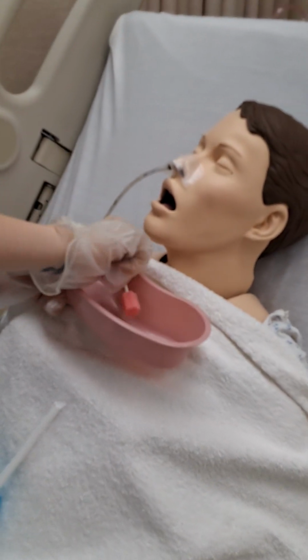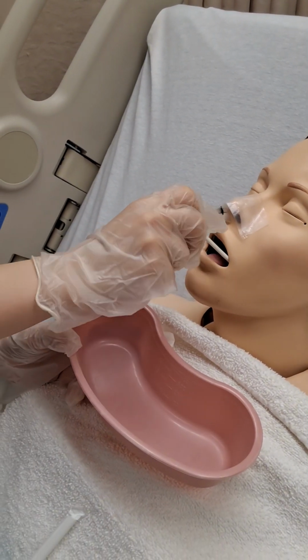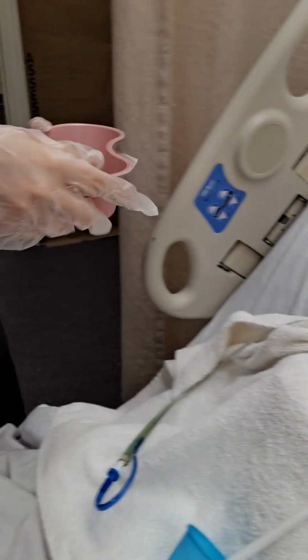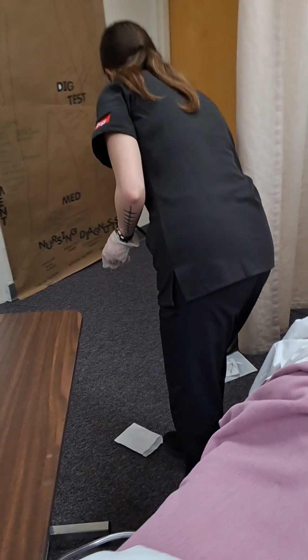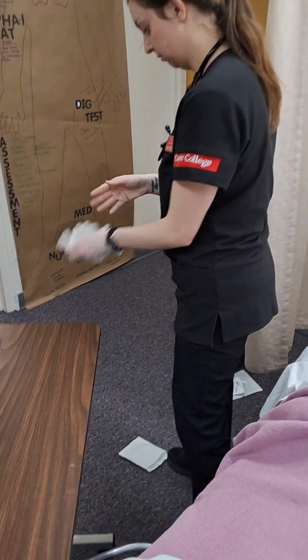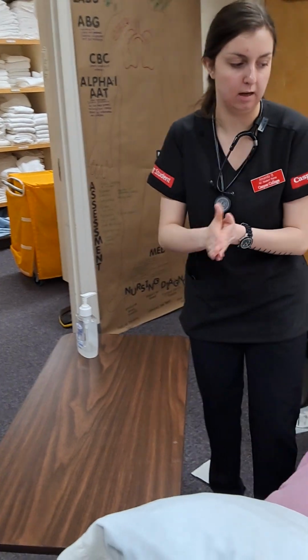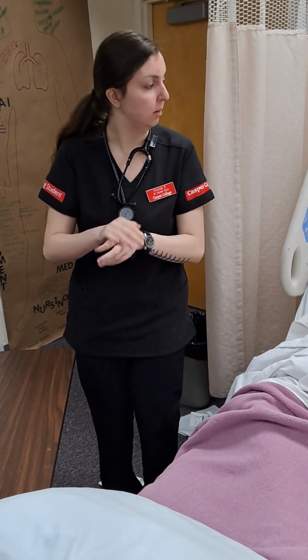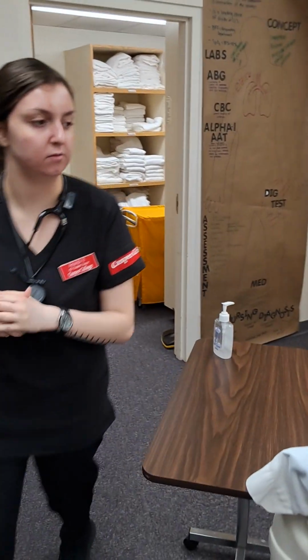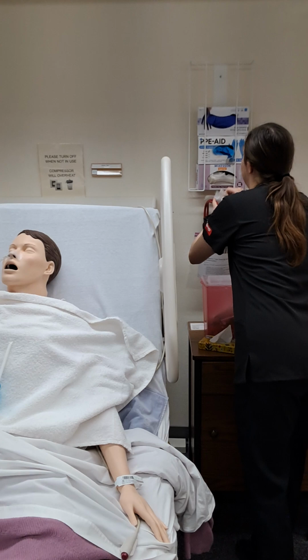Okay, I'm going to do some oral care on you. There we go. Now this is going in the trash as well. I'm going to dispose of all my equipment. Take off my gloves. Perform my hand hygiene, and now I'm going to make sure that he is safe. Let me take that towel off of you. Would you like your water? No? Okay.